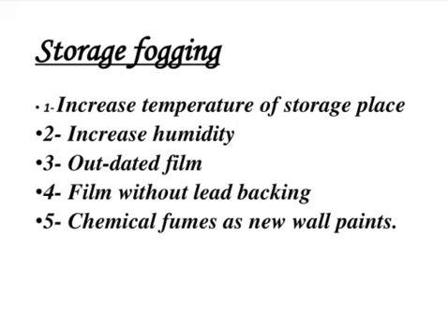Storage fogging occurs again in the dark room where we store the films. The films should have proper humidity and temperature for storage. If there is more temperature, more humidity, or the films are expired, that means outdated, then there are chances that the films stored in the darkroom become fogged or unclear.